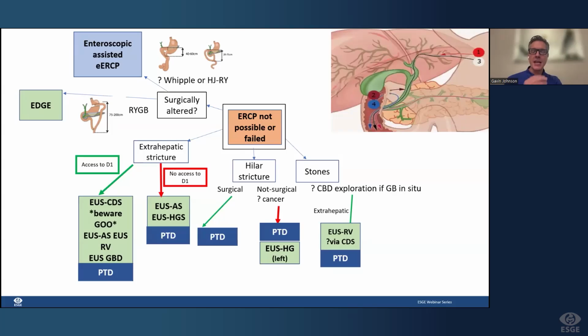What we've found, particularly in sick patients, is that it's perfectly acceptable to put a small LAMS in, so a choledochoduodenostomy, to temporize the patient who's cholangitic, an old patient with a big bile duct, and then bring them back a couple of weeks later to do an option 4 rendezvous via the LAMS. When the patient's controlled, you've got much greater wire access. You can go again with your wire to flick it down. And we've got a good case series on that where it's been quite successful.